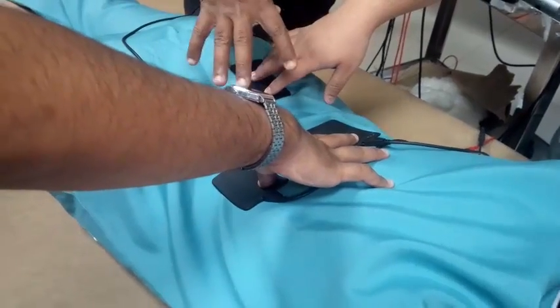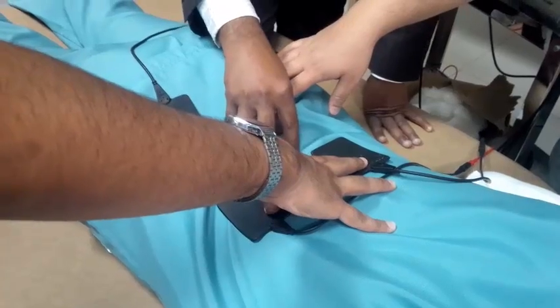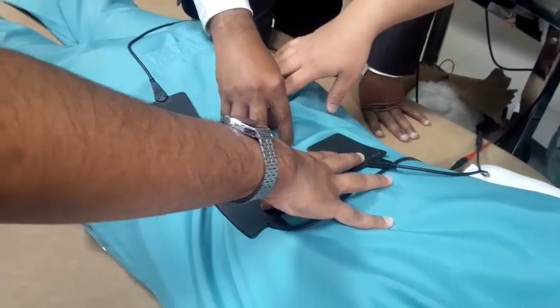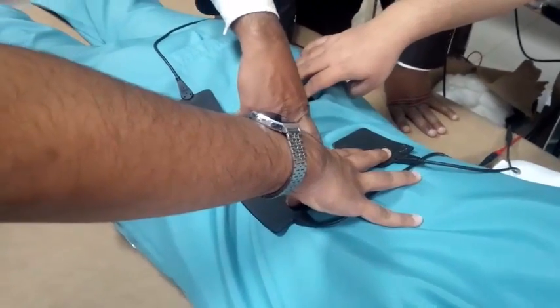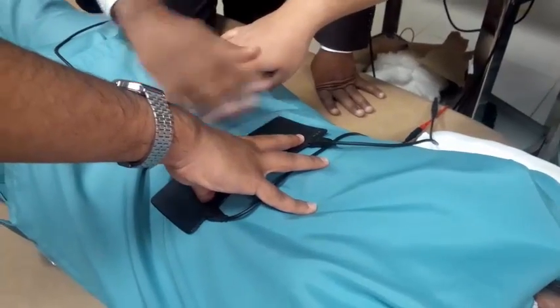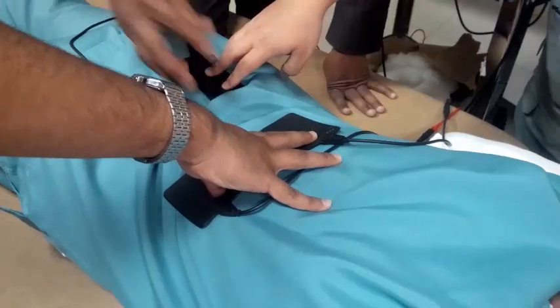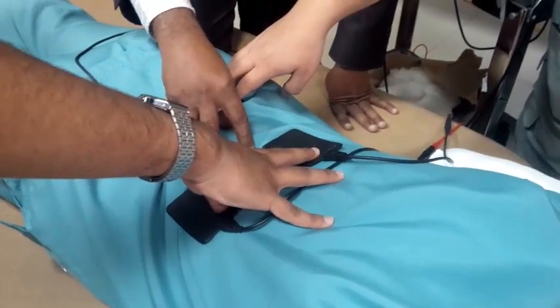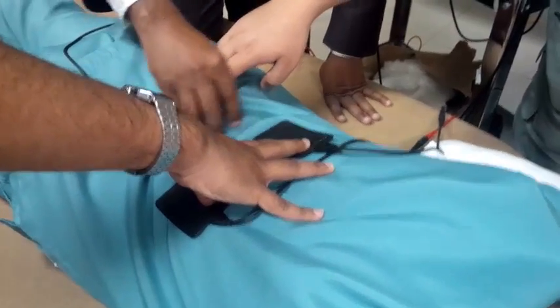The main effect will be on the focused center. Suppose the patient is having deep pain here. I can arrange channel 1 electrode and channel 2 electrode something like this. It is not canon, you can fix it on either side, so the placement can differ. But the resultant beat frequency, or amplitude modulated frequency, will be at the center.